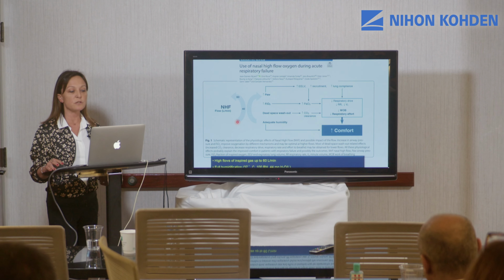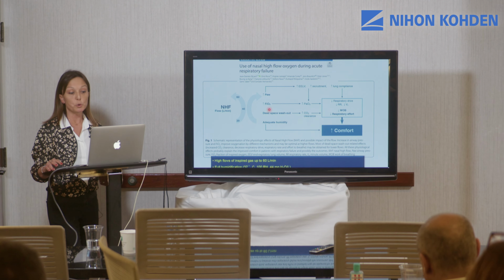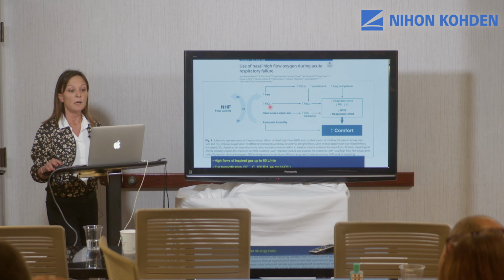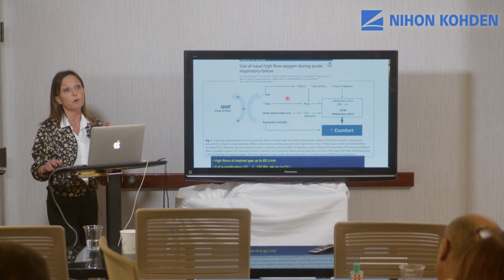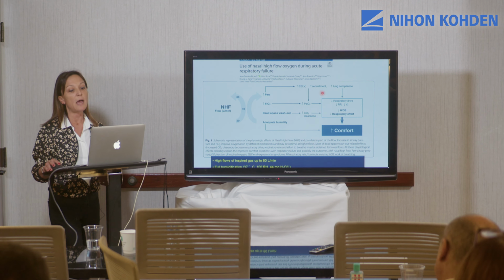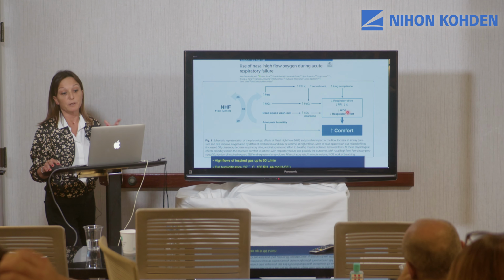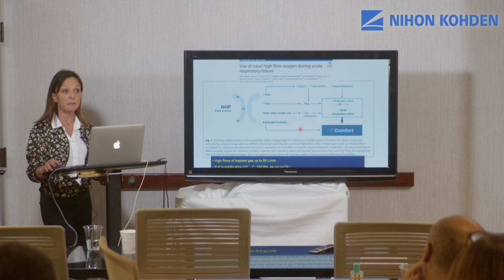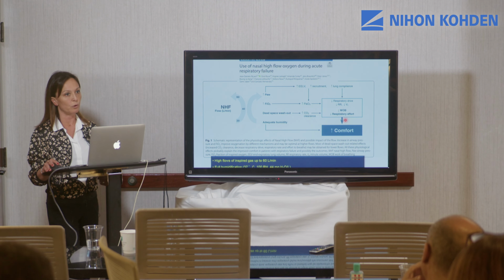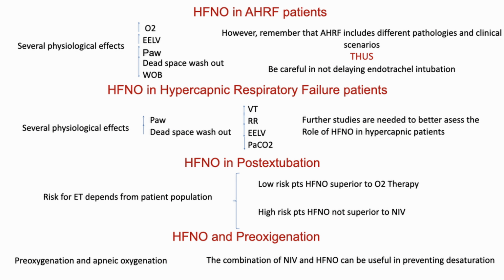they explain that because of the benefit and the physiological effect of high flow nasal cannula, we may assure higher FiO2 to our patients. The high flow and the distending pressure may increase the airway pressure, and thus we can increase the end expiratory lung volume. We can reach a little bit of recruitment and increase lung compliance, and these help us in reducing the patient respiratory drive, respiratory rate. And on the other side, because of the humidity and the high temperature, we increase the comfort of the patient. But as you know, we have many kinds of different acute respiratory failure.